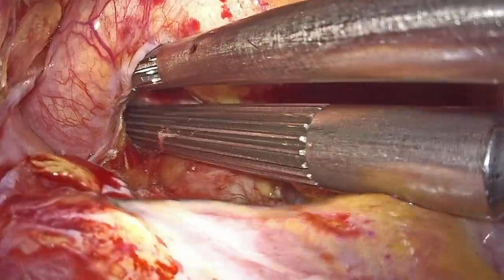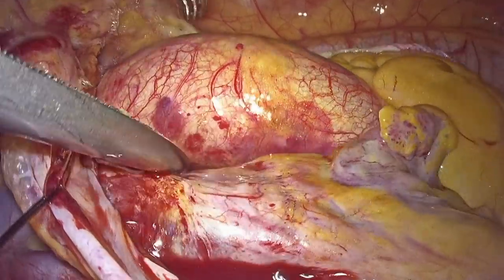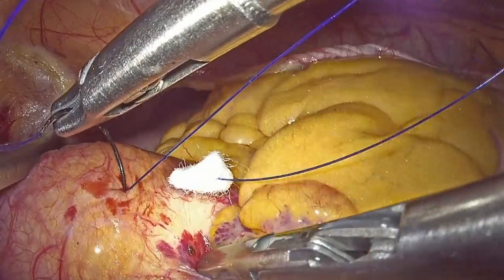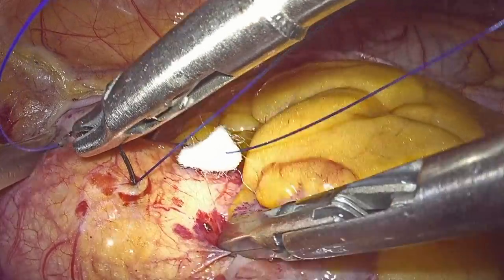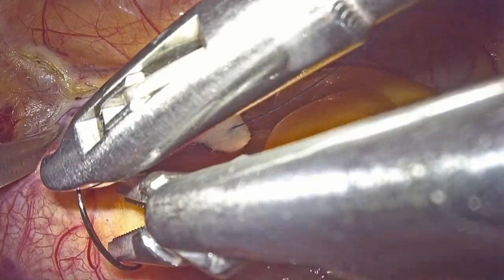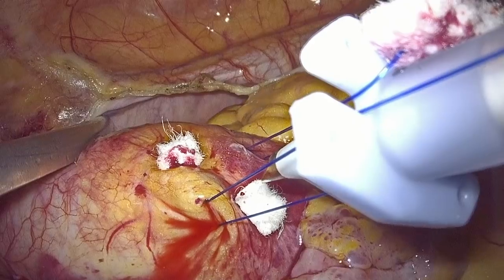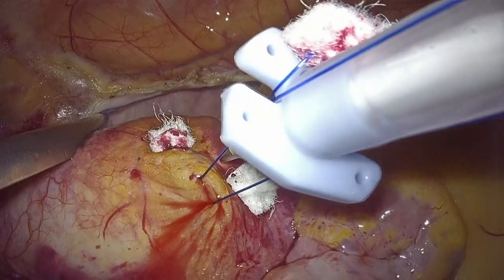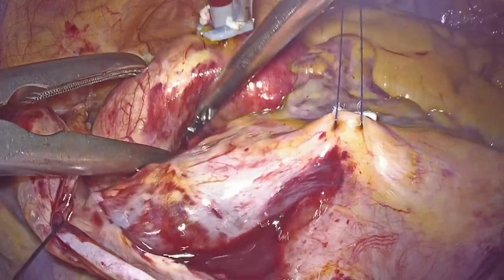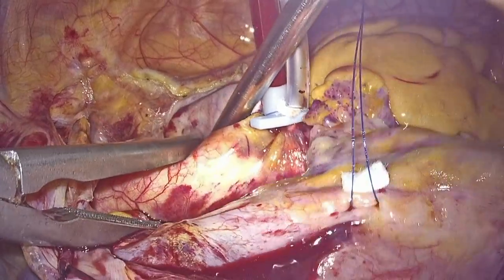We then insert the Chitwood clamp with the jaws facing upwards. A pledgeted purse string is placed on the anterior surface of the ascending aorta to be used for the cardioplegia line. The same line will be used for de-airing purposes after removing the cross clamp at the end of the procedure. The aorta is cross clamped and custodiol cardioplegic solution is administered in the aortic root in order to arrest the heart.